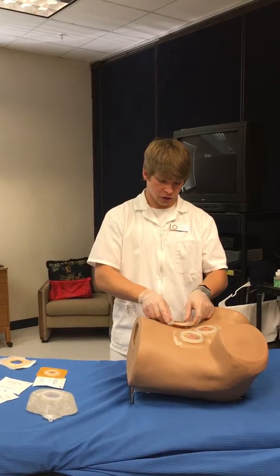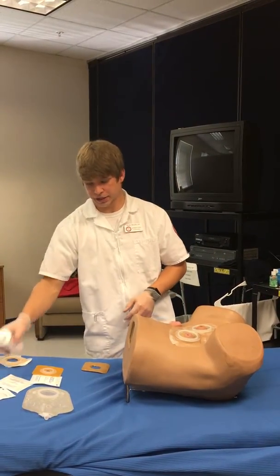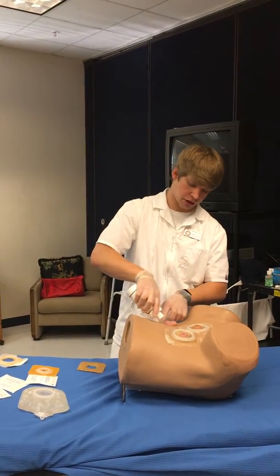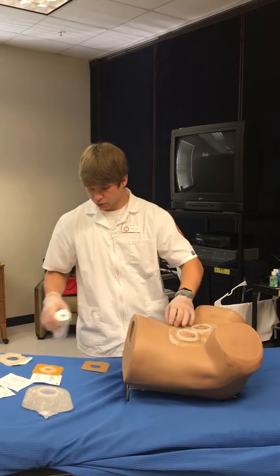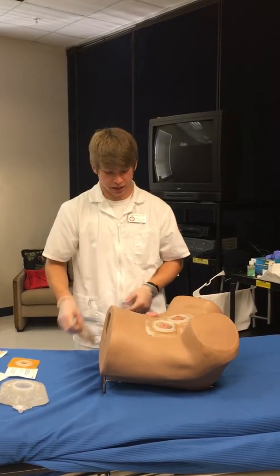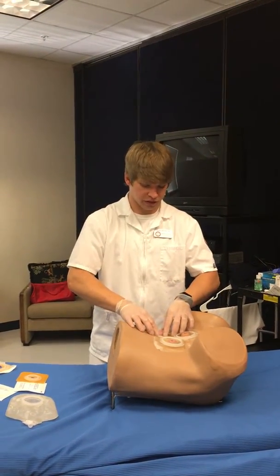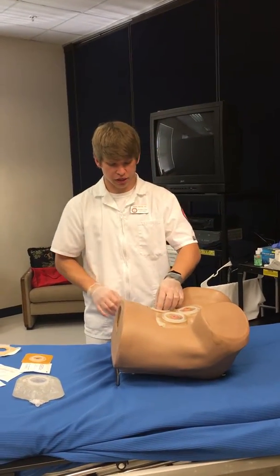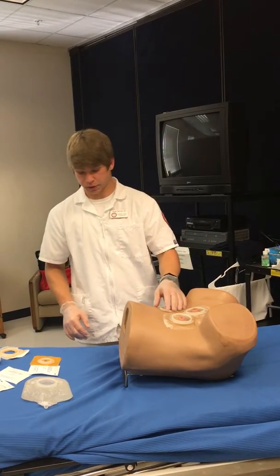After you've cut it out, measure it one good time, then take it off and get your stoma paste to decrease any irritation to the skin. Put it around and dab it around, making sure it protects all the skin — don't put it in the stoma, just around it. Then take the pad you've already measured at one eighth of an inch, place it on the patient, and make sure it's not causing any restrictions or cutting off blood flow. You want it to be a good snug fit.